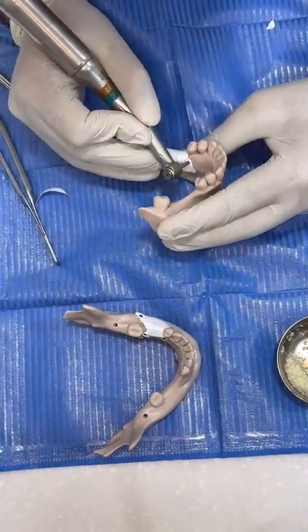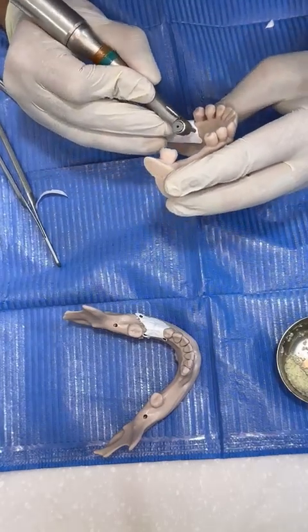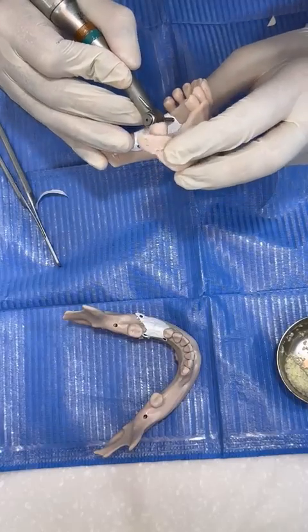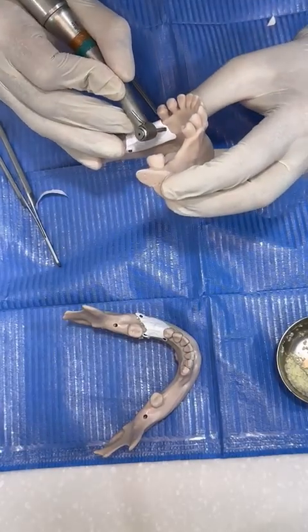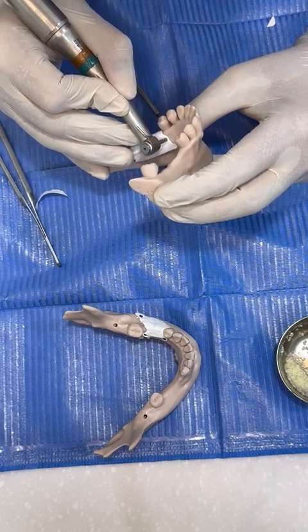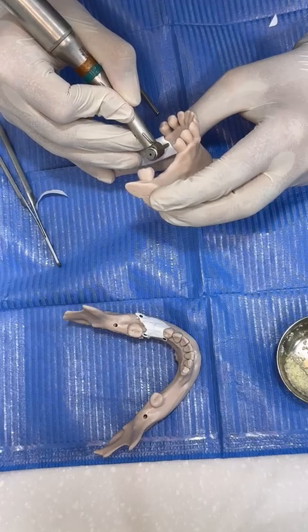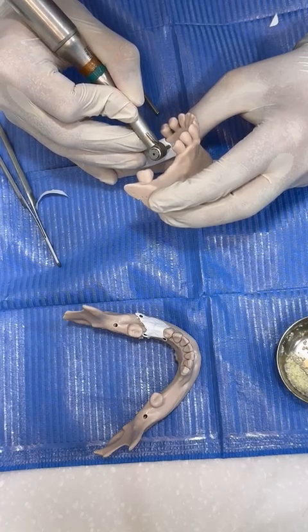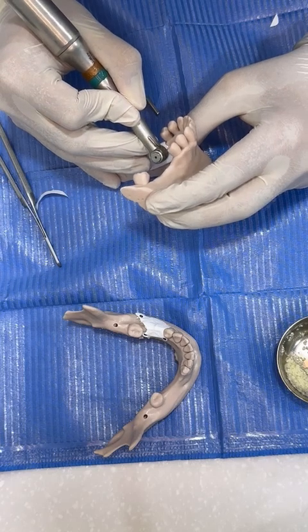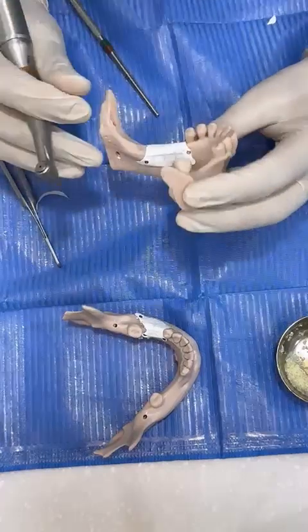If I find the screw is not in the right place, I can remove it and put it again. But here I can continue with the manual driver and see if I can continue. I will do. Okay, this is the second screw.